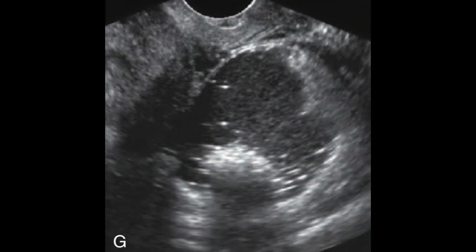You have to take the measurement of this cystic lesion and then mention that there is a fine reticular pattern, which is called dermoid mesh, and beside this there is also a highly echogenic reflective lesion casting acoustic shadowing, which is called a dermoid plug. So in this cystic lesion there are two patterns: the one is dermoid mesh and the other is dermoid plug.